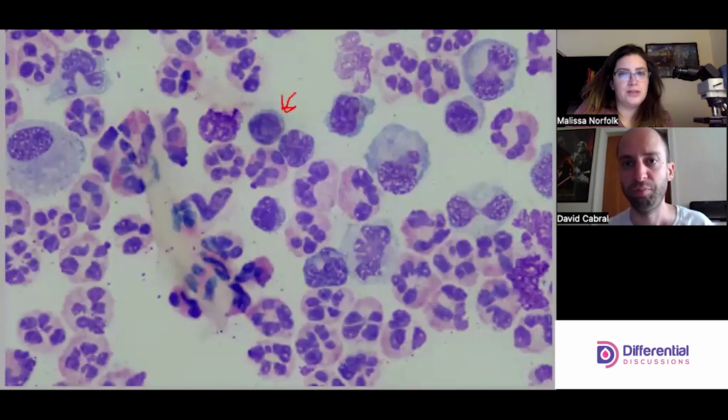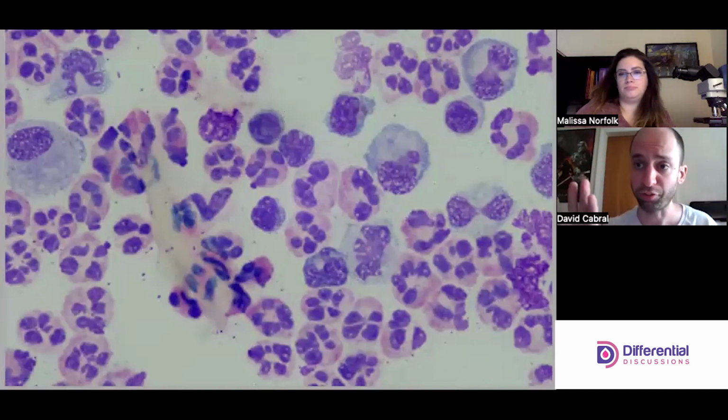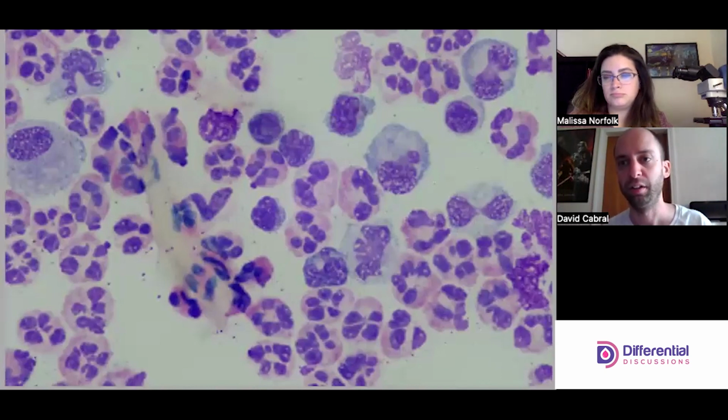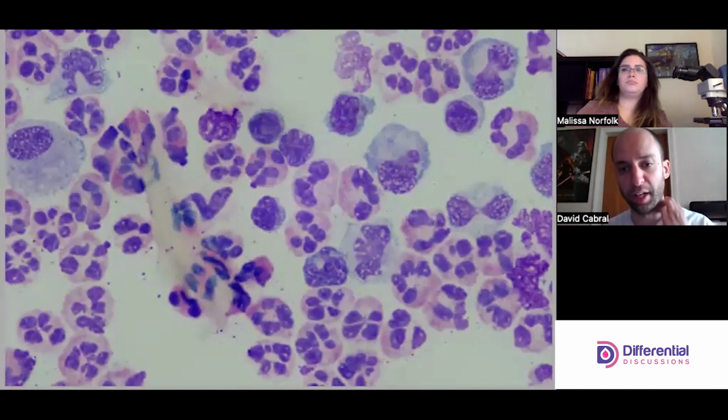The other thing is the nucleoli will be more prominent in lymphocytes. This is one of the big struggles for someone who learns peripheral blood and then moves into body fluids. Stuff looks scarier, right? Those little features that would look somewhat normal on a peripheral blood are going to look intimidating in this format.